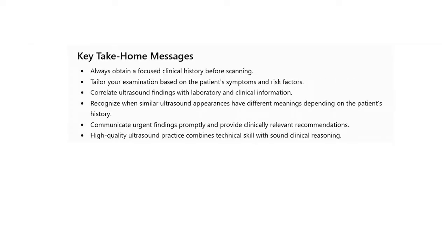So the key take-home messages to you, ladies and gentlemen, always obtain a focused clinical history before scanning. Tailor your examination based on the patient's symptoms and risk factors. Correlate ultrasound findings with laboratory and clinical information.